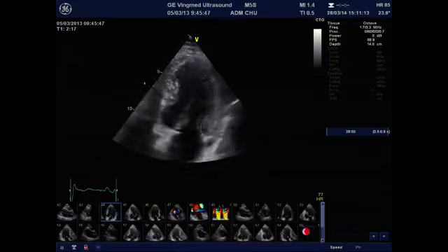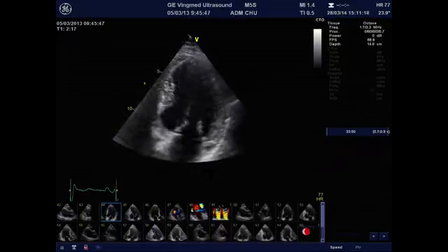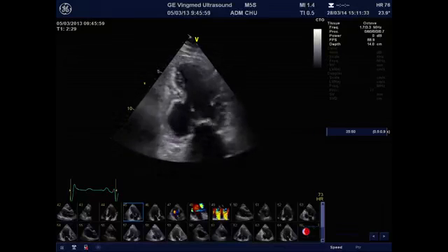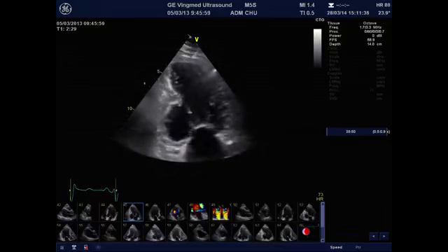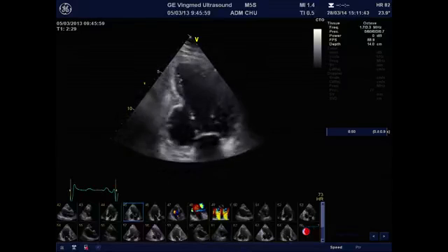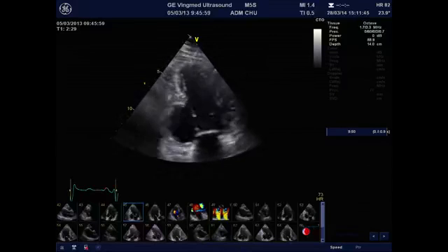Well, this looks a little strange at the level of the posterior septal wall in the basal part. It looks akinetic. So we move the probe counterclockwise to obtain the two-chamber view. And this is a surprising finding. You see that there is an infarct at the basal one half of the inferior wall, good contraction of the anterior wall, and aneurysm, or at least infarct expansion.